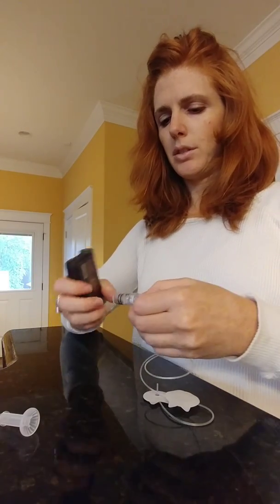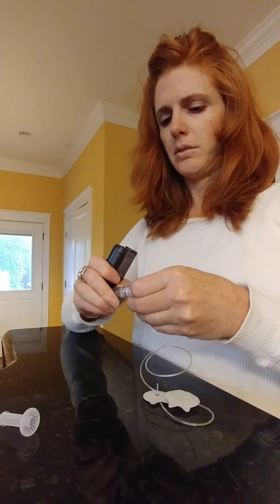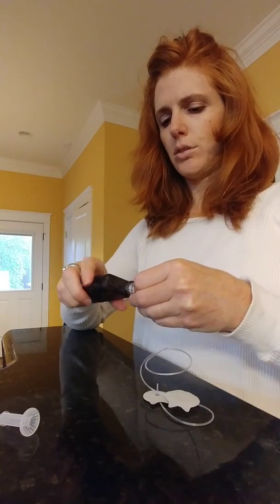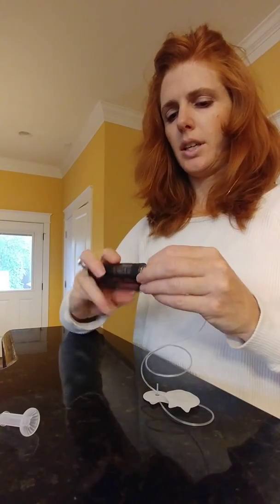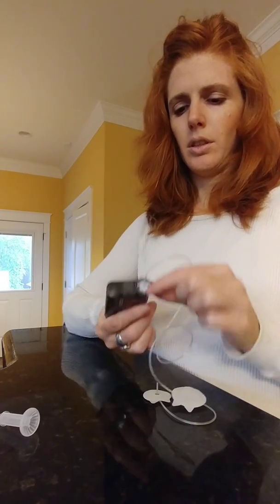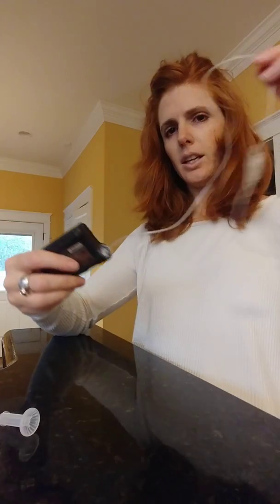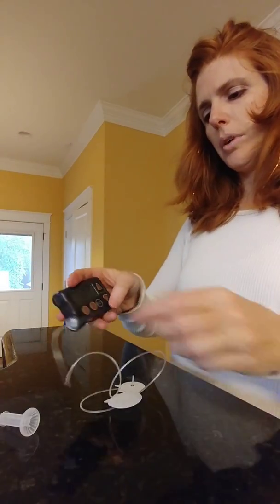And then I'm going to place the new one in, just making sure it's screwed on, and then I place it down, and it falls nice and flush so that these little plastic pegs are sitting in the right spot. So all you do is tighten clockwise. So now everything's connected. We have the site connected to the tubing, connected to the pump.